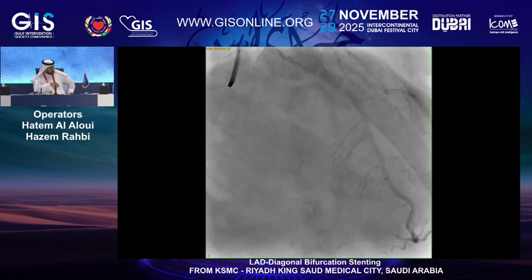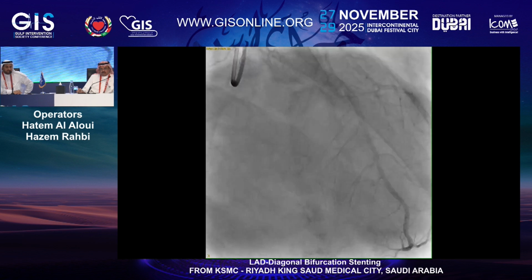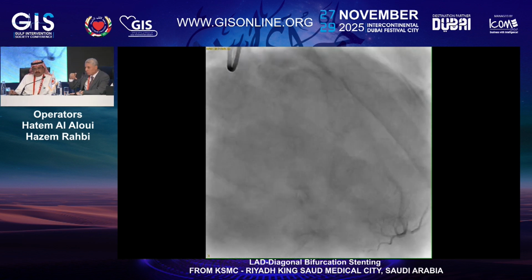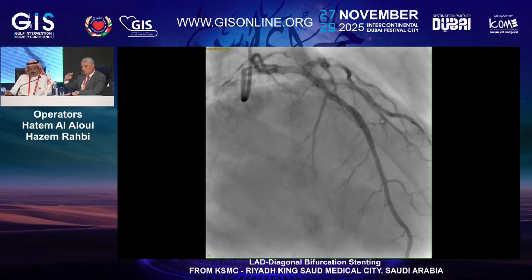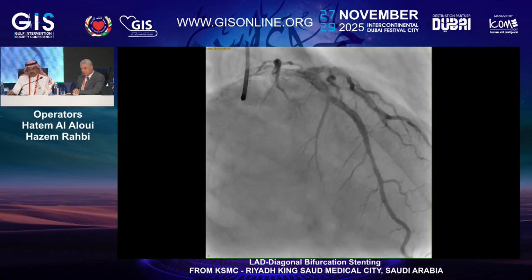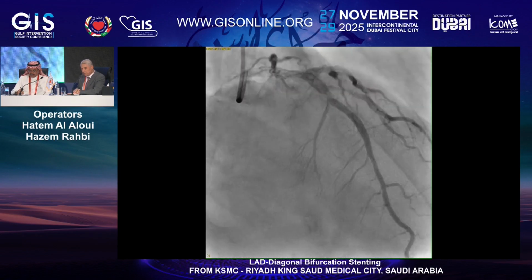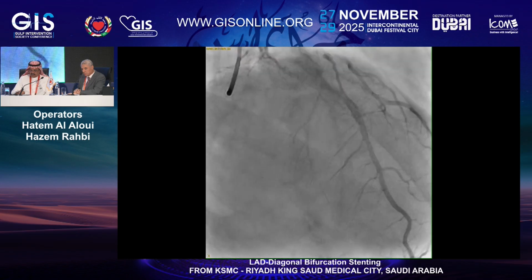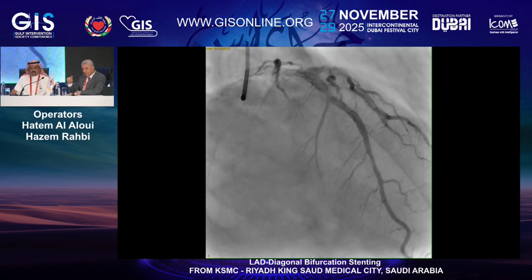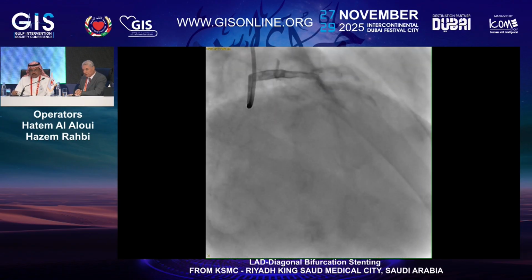You see, there's a plaque. It's not significant, obviously, just above the lesion, and if you place a stent over there, that lesion might look more exaggerated, and then you would maybe need to think what to do about it. So there are many questions to be asked, and I think imaging in this particular case is absolutely crucial, because it will, first of all, re-evaluate that plaque and define what would be the landing zone for the stent of the LAD.